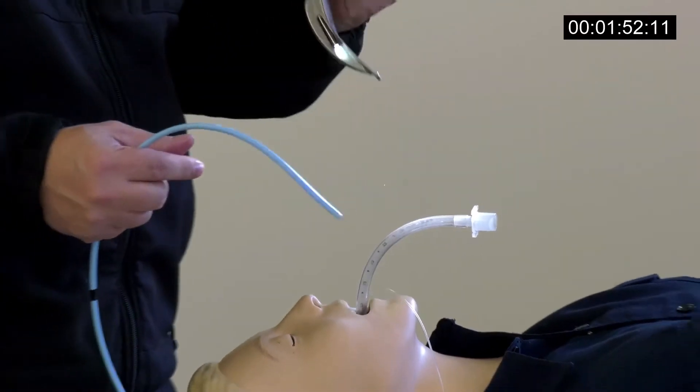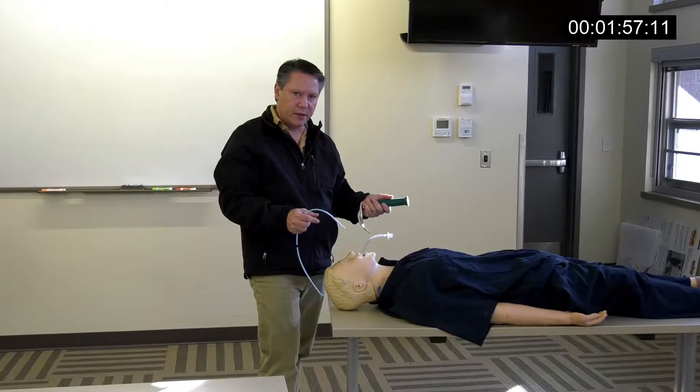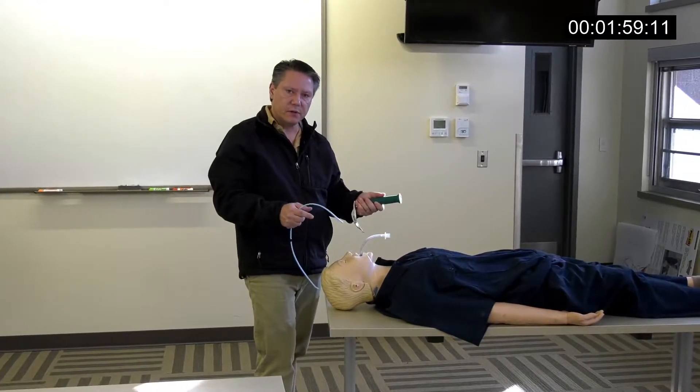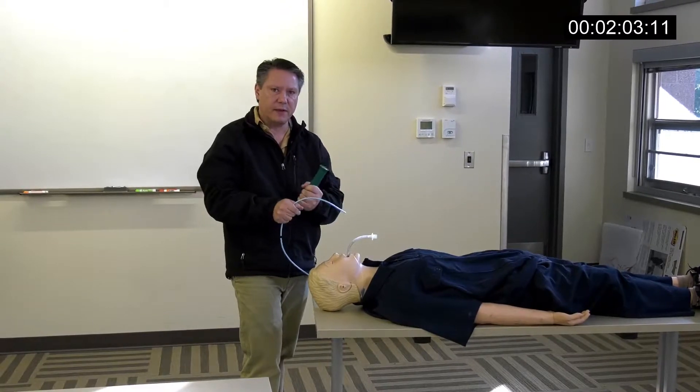The advantage of this is: by locking this to the handle, you keep the blade in the mouth, which gives you the opportunity to see a little bit better as you float the tube in there, and it makes the tube go in a little bit smoother. Give it a try. Thanks a lot.